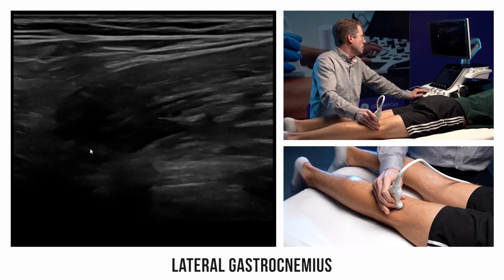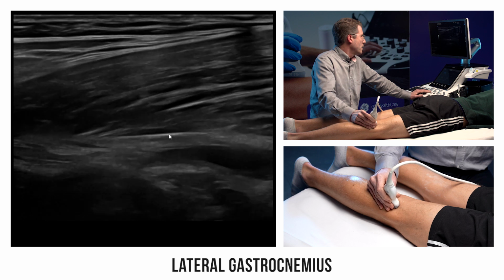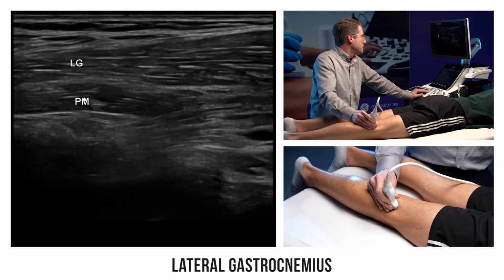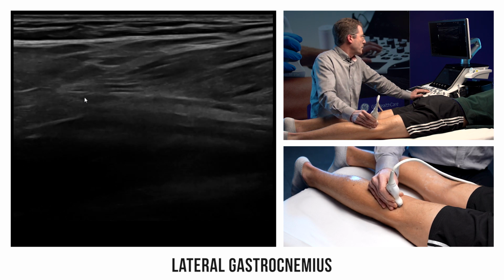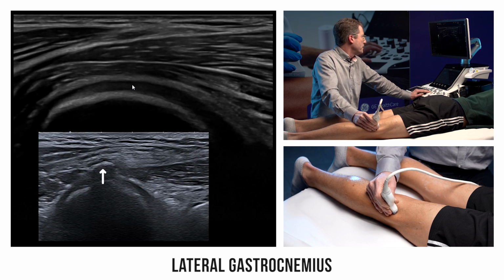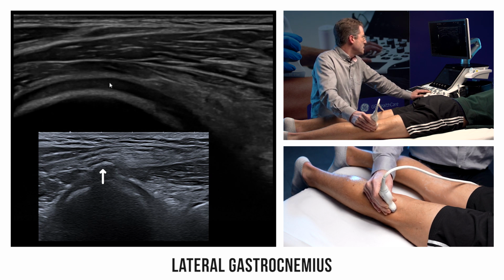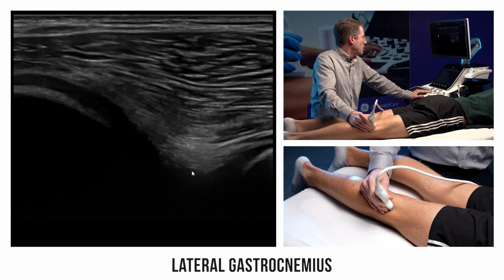Under the lateral gastrocnemius, we can find the muscle belly of the plantaris muscle. Behind the lateral condyle, we can sometimes see a small sesamoid bone, the fabella. Like in the medial compartment, we aim to analyze the posterior condylar cartilage and also the meniscal rump.